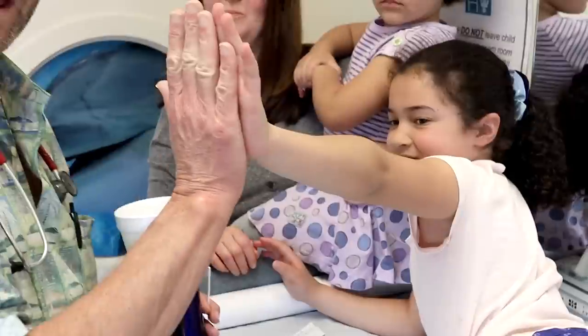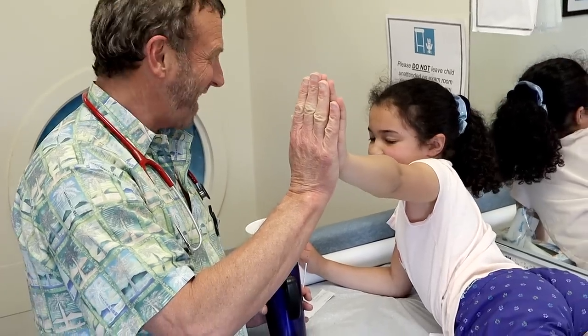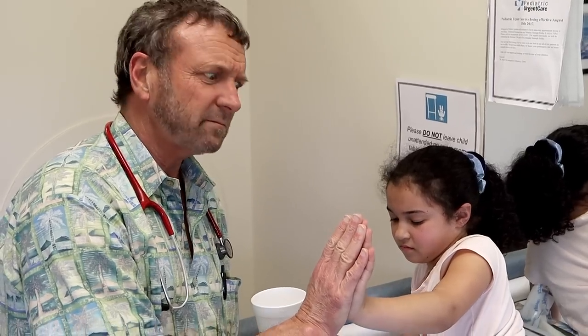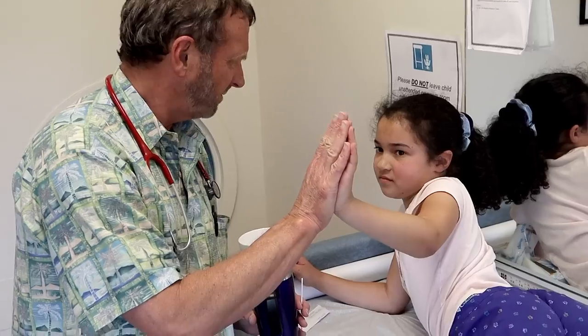Alright, we'll call it quits. We're gonna have to hold the high five — this is the longest high five for the bravest wart patient we've ever had. Molluscum contagiosum, folks. It lasts a long time. It's been here for a year. Untreated, often I tell patients it lasts for like two or three years.